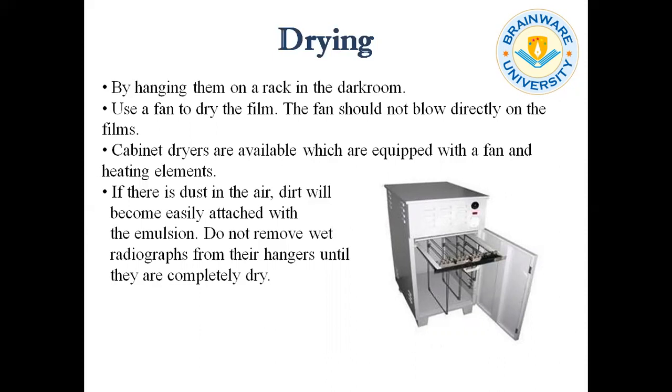So it is important not to remove the radiograph from the hanger before it is completely dry. Once the radiograph is completely dry, you can remove it from the hanger and hand it over to the patient.